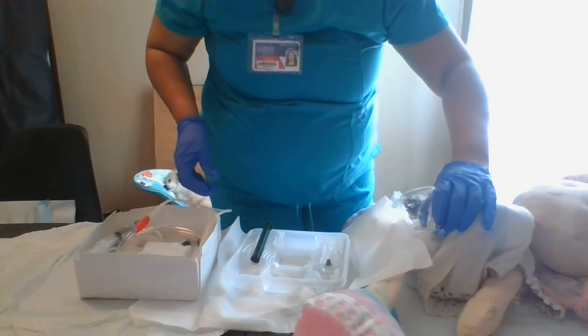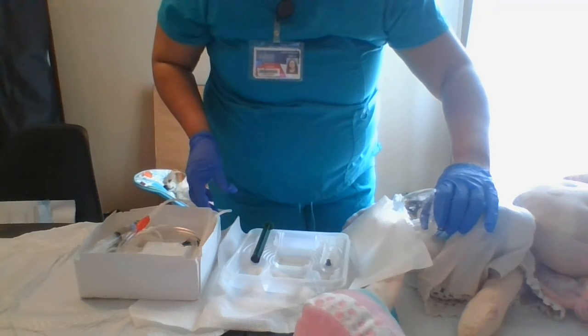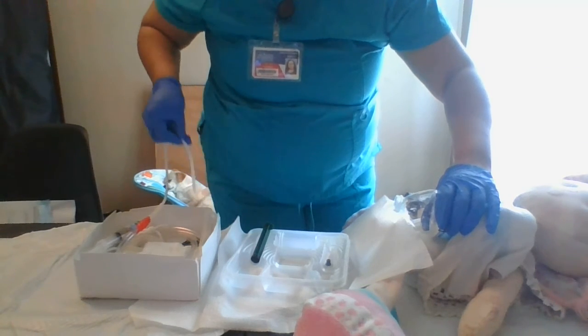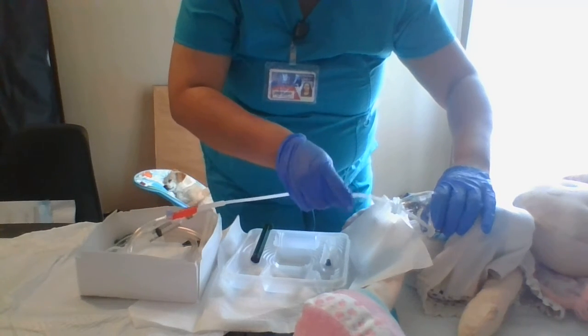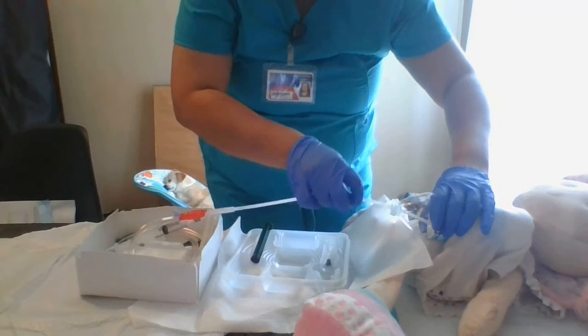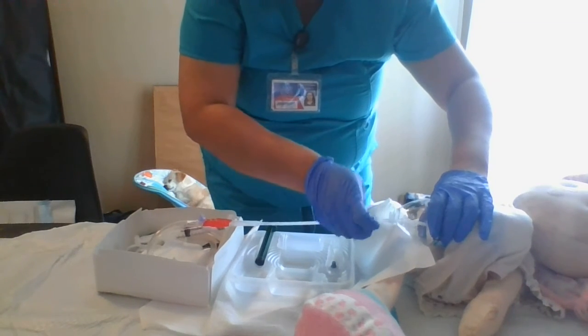Now I will proceed to insert my catheter. I will insert until I see urine, then I will go 2 inches more. I see urine. I'm going to go another 2 inches.